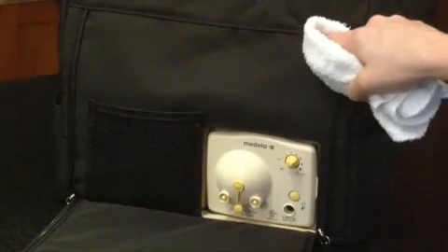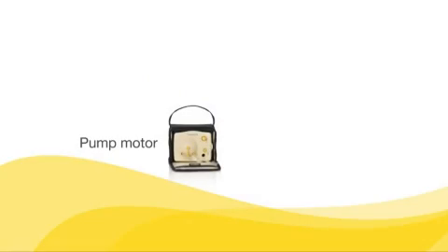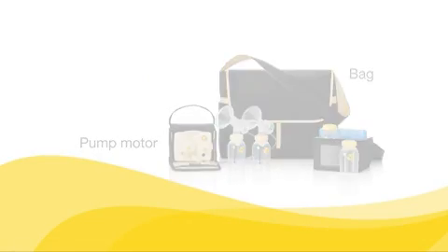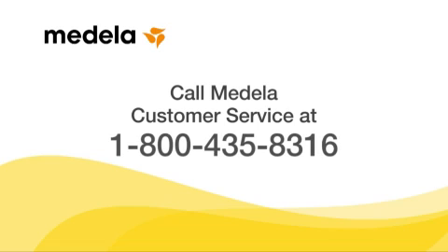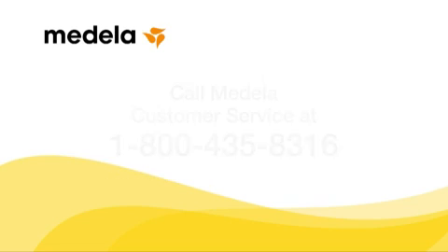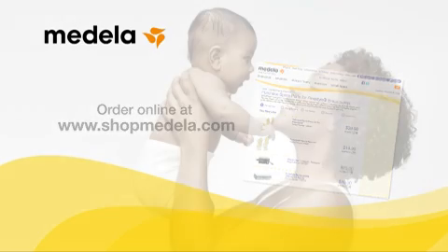Use a damp, not wet cloth to wipe the bag when necessary. Do not immerse the motor unit or any part of the pump bag in water. If you need assistance with your assembly of your Pump in Style Advanced, please call Medela Customer Service at 1-800-435-8316 or email customer.service@medela.com. If you should need to replace parts, visit www.shopmedela.com.